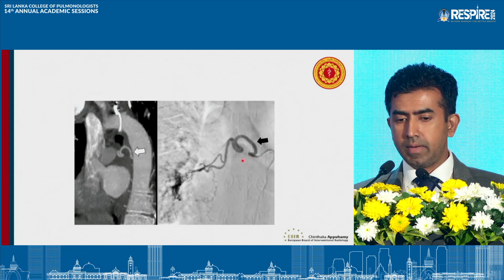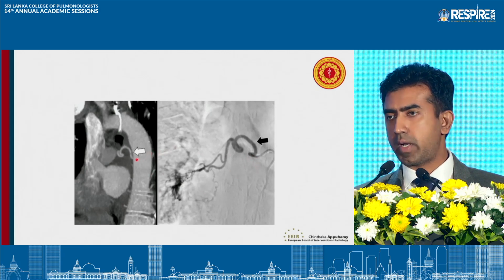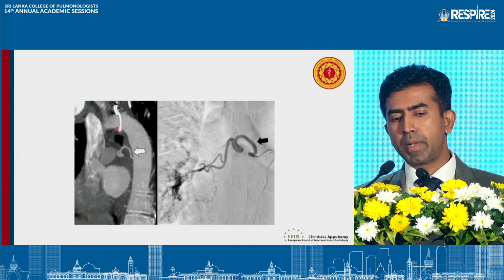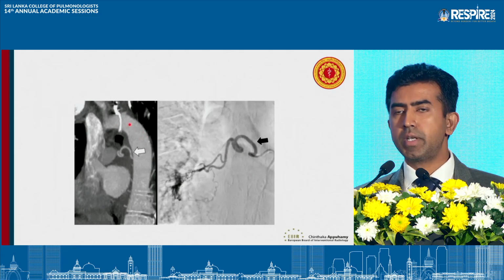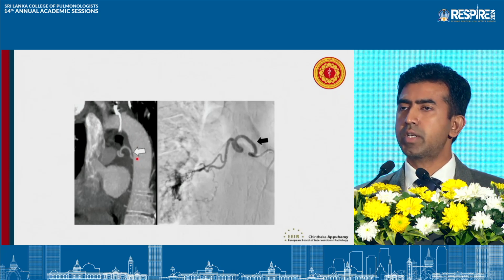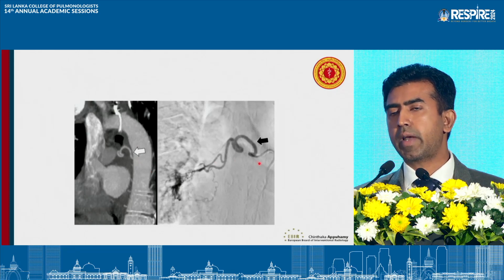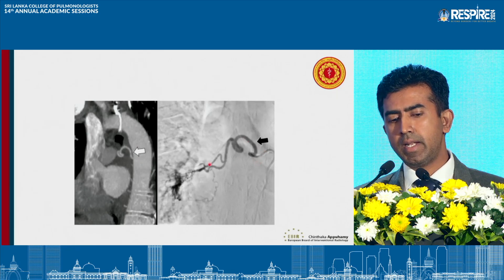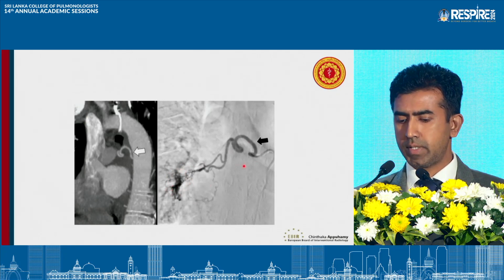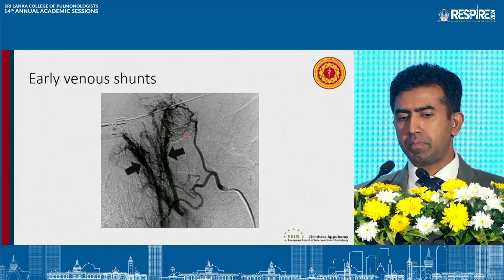And another variation, the right bronchial artery directly arising from the aorta. So that's why I told you the pre-intervention imaging may be very useful. Now with this patient, we know the location of the origin of the right bronchial artery, so superselective cannulation was easy. This is the pathological blood supply towards the central part of the lung, and it was embolized.